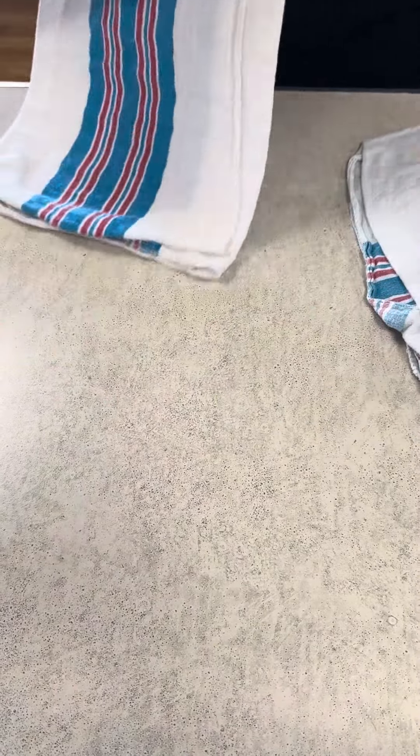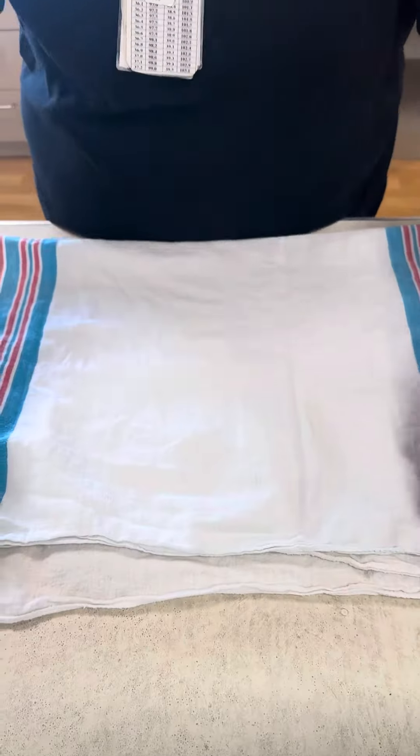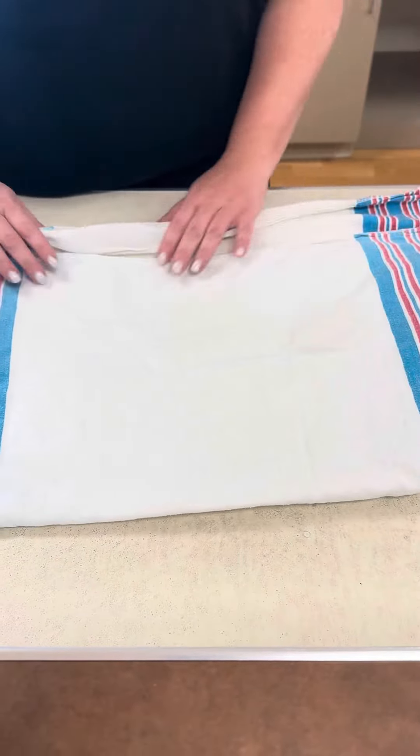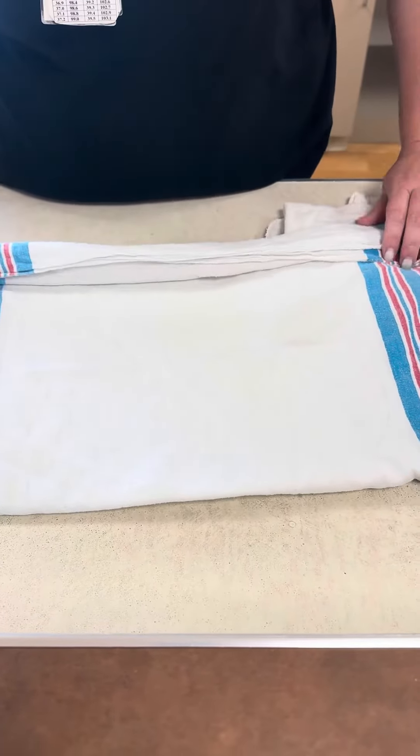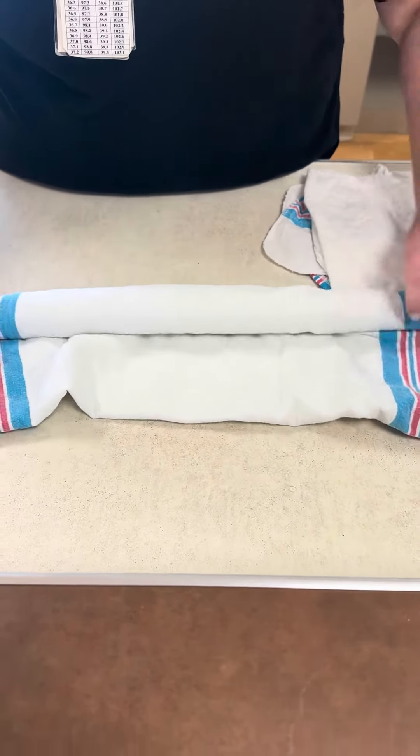There are different ways to do this, but I take two blankets, open them up fully, and stack them together. Then I fold that in half and lay it on my table. I take the ends and roll them into the middle so that there are no rough edges against the baby — rolling this really nice and tight.